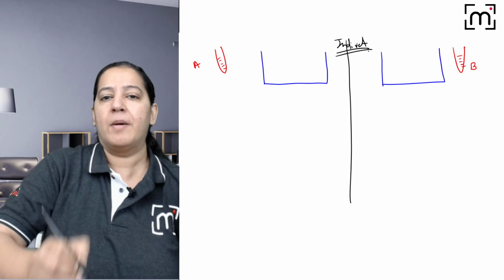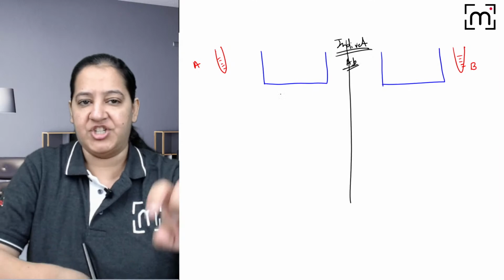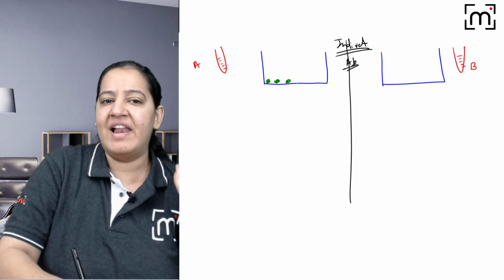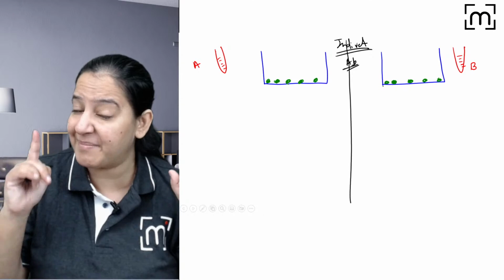In step 1, I want to test the antibody now, so I will start with antigen. So let me take antigen. You can use any colors, but the color should be different. So here I am coating the well with antigen. The HIV antigen is available in the market. Whatever antigen you are suspecting, that is available in the market. Start your test with antigen. This antigen is not from the sample. I am clarifying again and again. It is external.